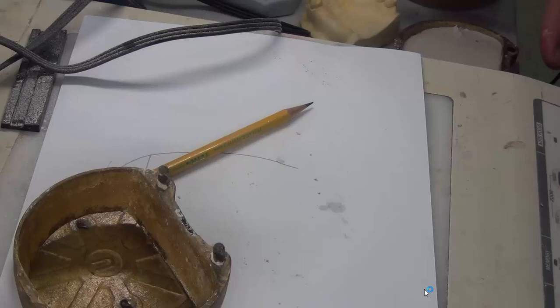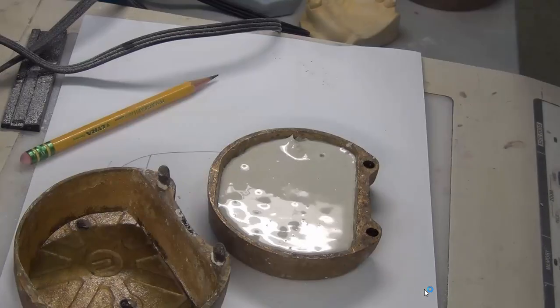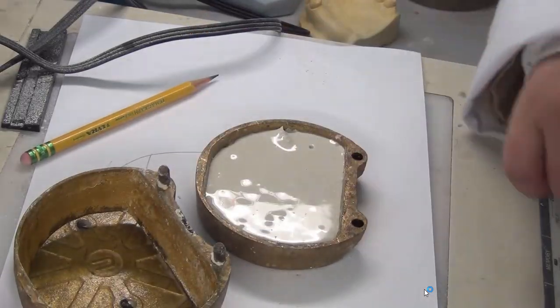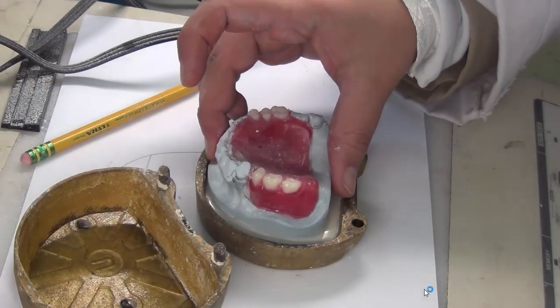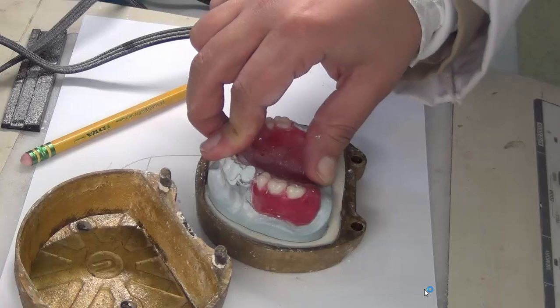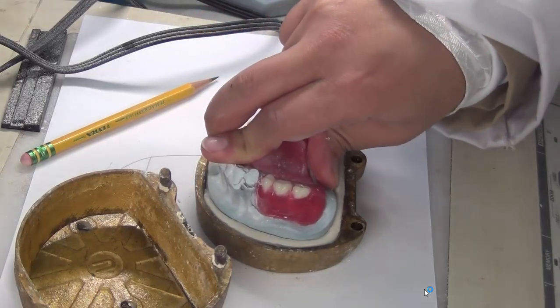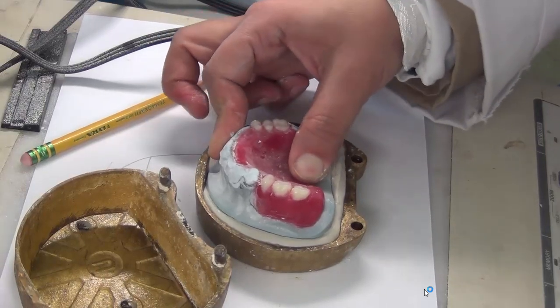The step after that, you're going to mix the plaster according to ratio, which is the water is 55 ml and the powder is 100 grams. Okay? We're going to mix according to ratio. And then we're going to put the plaster inside the lower member of the flask. And using the vibrating table, we're going to put in the cast under vibration. I'm going to do it manually here, but you're going to do it with a vibrating table.